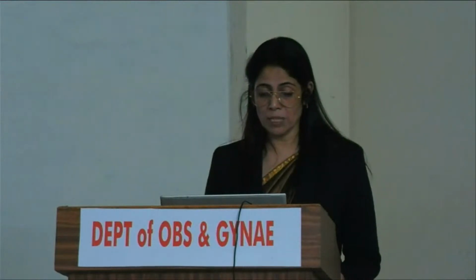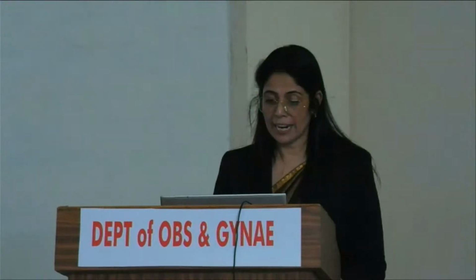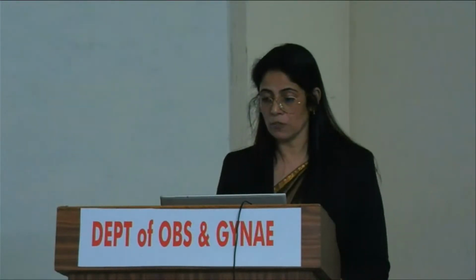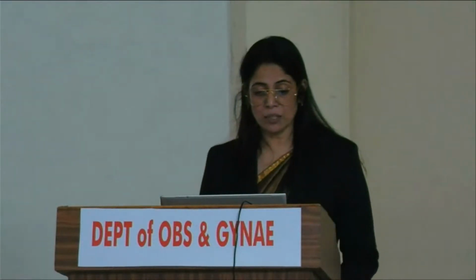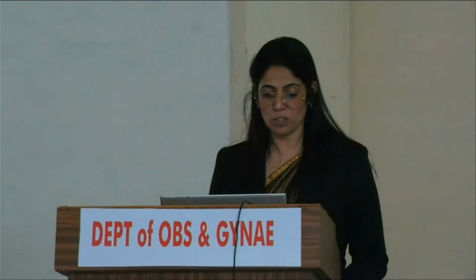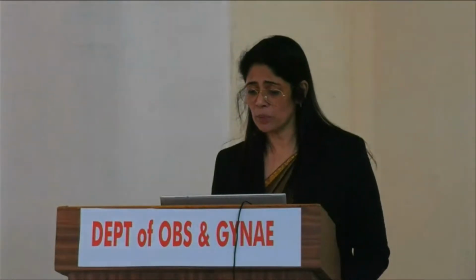In a mid-sagittal view, when you're doing a CRL itself, we detect so many findings. We see that the NT is increased. There is a megacystis, and at first look, we see that the IT is also widened. On a closer look, we found that the NT was 3.8. The nasal bone was present. The palate was normal, but the IT was widened.